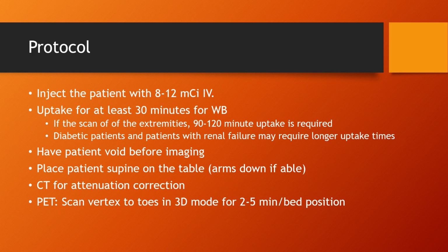Typically you go for 2 to 5 minutes per bed position. If you are scanning in 3D mode, you can go for 2 to 3 minutes per bed position and shorten the time a little bit. This is crucial in patients that are experiencing a lot of pain and it may be difficult for them to lay down that long.